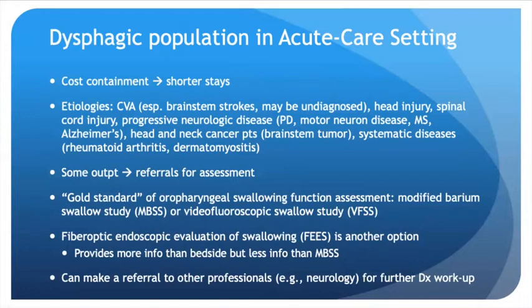Really, the gold standard of oropharyngeal swallowing function assessment is currently the modified barium swallow study, or the MBSS. This is also referred to as a video fluoroscopic swallow study, or a VFSS. Some people also refer to it as a cookie study, as a cookie swallow study. Another option is a fiber optic endoscopic evaluation of swallowing, or a FEES.